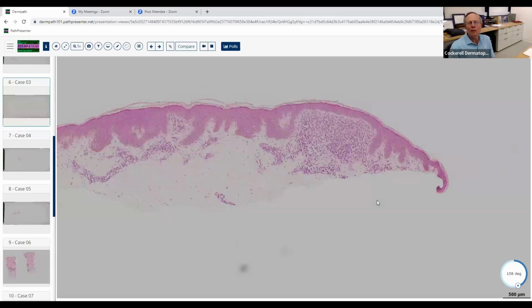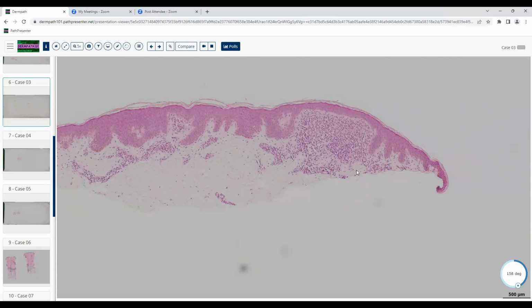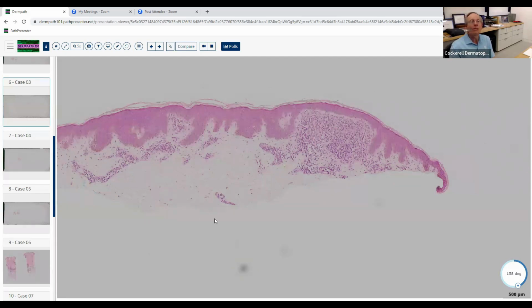And then if they put some other granulomatous things down there, like zirconium granuloma or something like that, those can all give you a granulomatous inflammation. But the key to this diagnosis is this pattern that you recognized. So that'd be a hard question if they put that. On a scale of 1 to 10, that'd be in the 2 or 3 category. It wouldn't be just an easy one. I doubt that they would do that to you, but just in case they do, you're going to be well prepared for it.